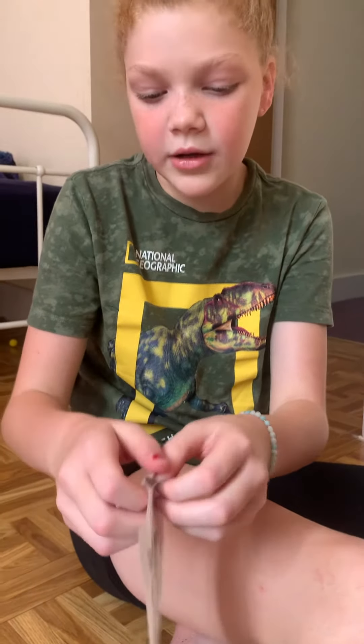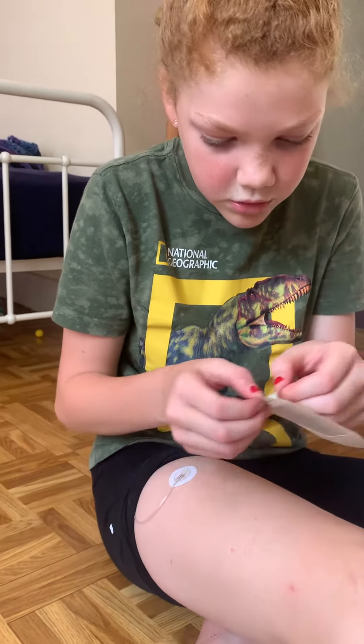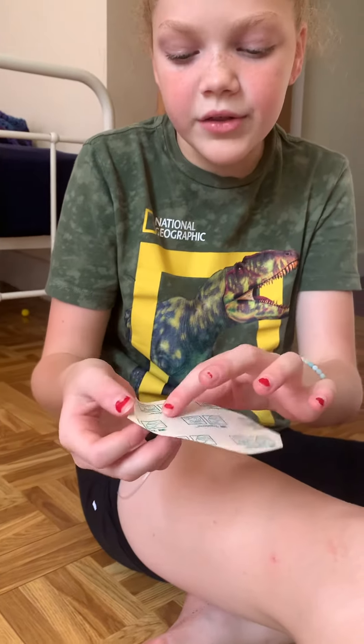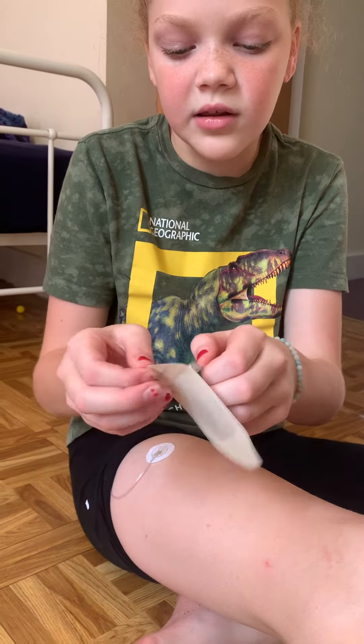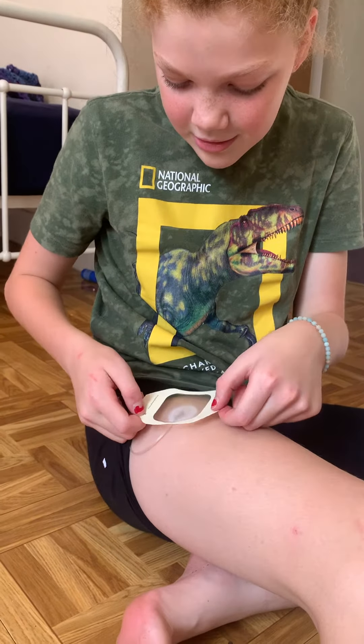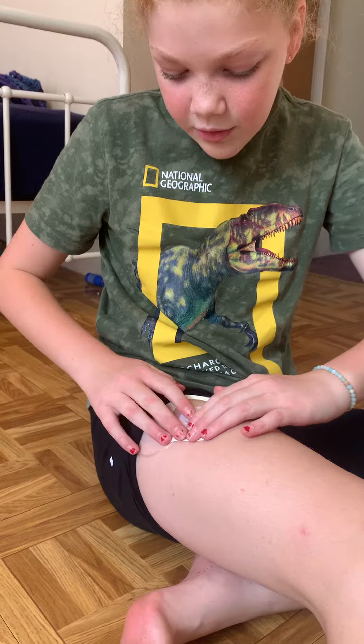So what I got to do is open this. This is the not sticky side, but this is on it so that it's protecting the sticky side. Now it's sticky — I'm not going to touch it. Hopefully I can do it perfect like I did this one day.